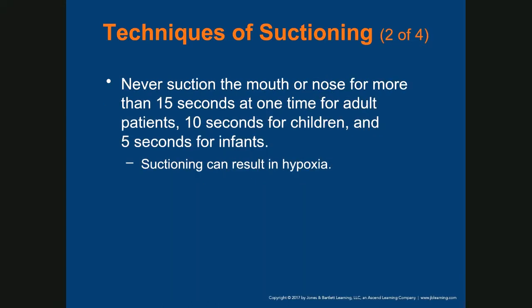Never suction the mouth or nose for more than 15 seconds at one time for an adult, 10 seconds for children, 5 seconds for infants. So it's 15, 10, 5. No more than 15 seconds for an adult, 10 for a child, 5 for an infant.